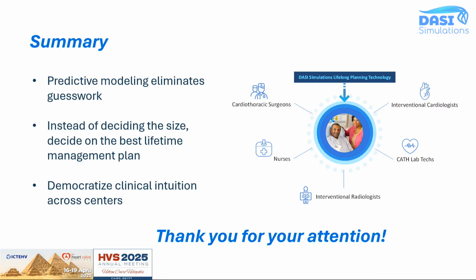And finally, just to wrap this up, predictive modeling does eliminate some of the guesswork that comes with TAVR planning. Going back to the lifetime management component, instead of just determining the size of the valve, it's really important to optimally determine not just the valve type and the size, but also the deployment depth and many other structural parameters, and how this could potentially impact risk of complications.